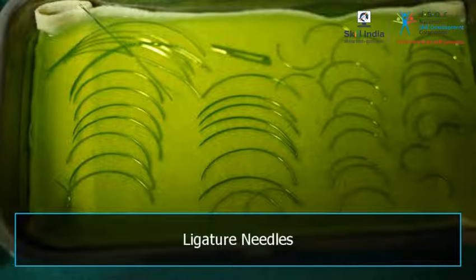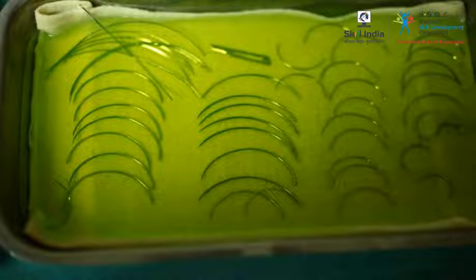Ligature needle is a curved needle which can be attached to a thread. This needle is used to make sutures. There are different types of ligature needles based on the thickness of the sutures that need to be made.